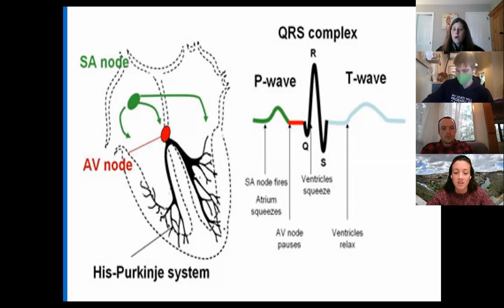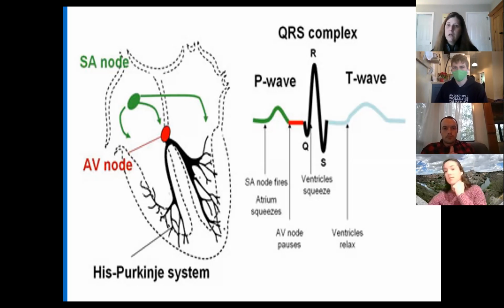Okay, if you see something wrong with the QRS, you should know that that's something going on with the ventricles. And then you further define what it is. It's not just a memorization like, oh, the P comes from the atria and the SA node and the QRS comes from the ventricles. You need to know the detail. We don't ask, like Dr. Benetti said this morning, we ask very few knowledge-based questions. You have to have the knowledge to make a right decision and to understand, okay? But you do need to know what part of the EKG represents what part of the heart, okay?